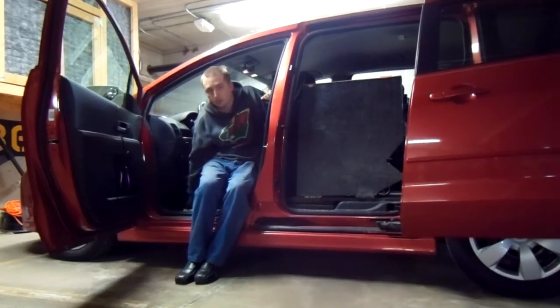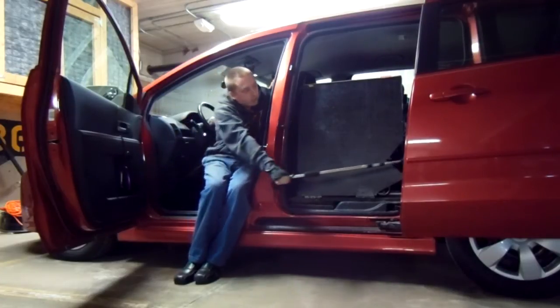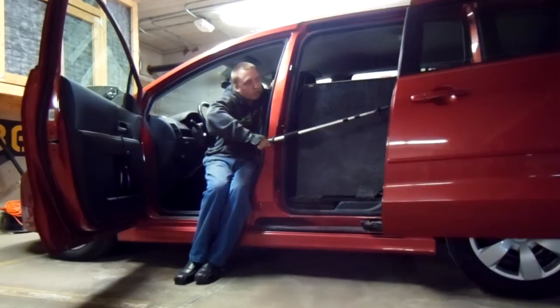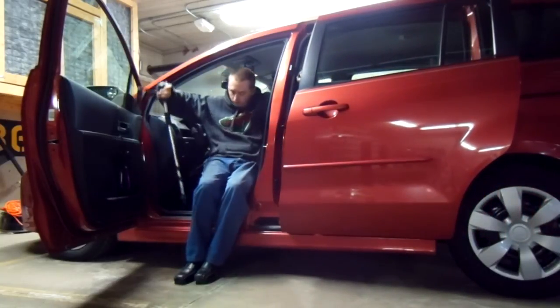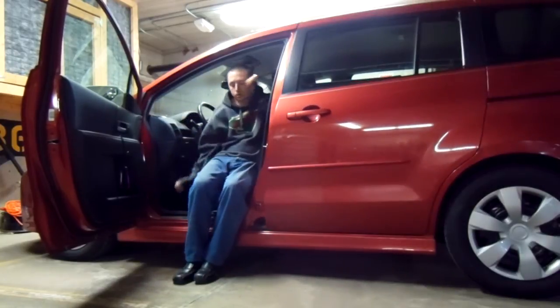I used to have a rope system to close the door but that was a little tricky, so I just put a strap on the existing door handle — I only had to drill one hole. I got this little walking stick with a hook on it to pull the door, place it on the latch so it can close, then just move the door the rest of the way.